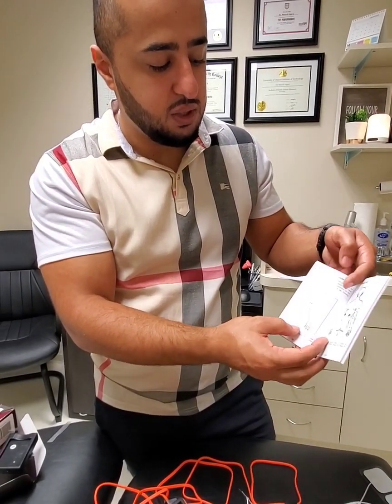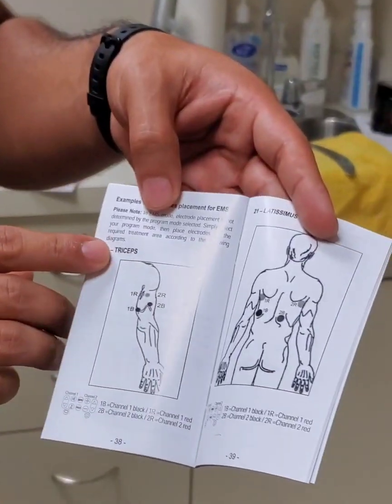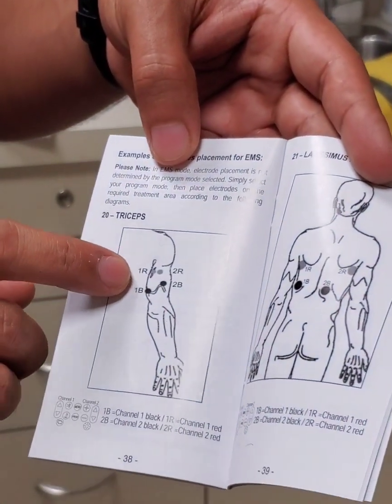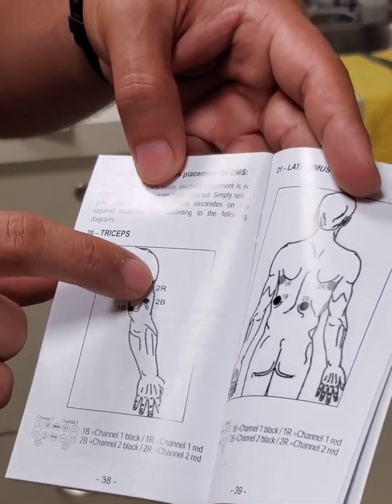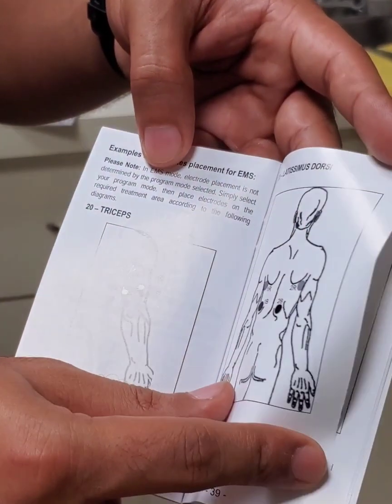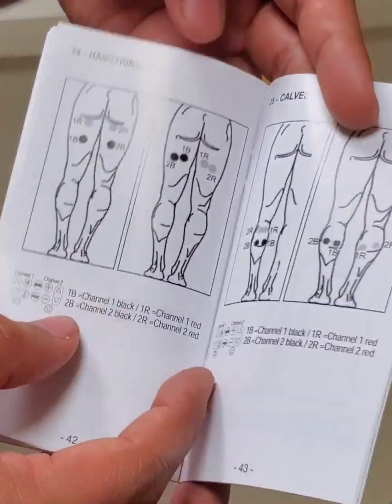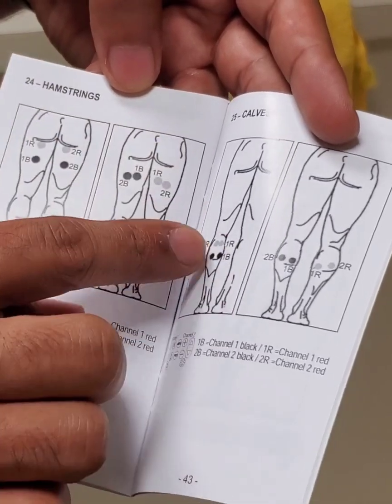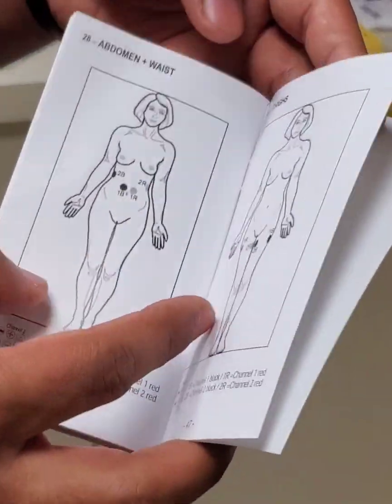After the TENS section, the book goes into the EMS pages, which are more targeted towards muscles. Same thing — one R and one B stands for one red, one black, and it goes up like this, and then channel 2 goes like that. It covers your lat muscles, lower back muscles, glute muscles, hamstring muscles, and calf muscles — it tells you exactly where to place them on your body.